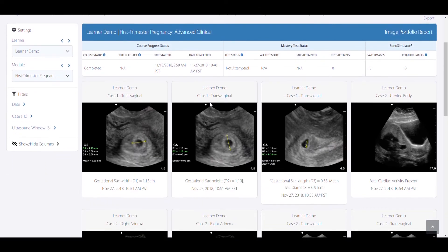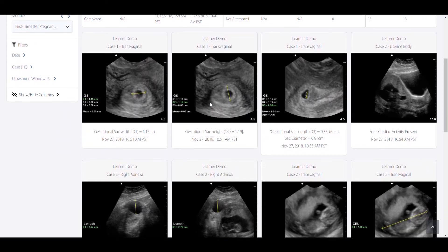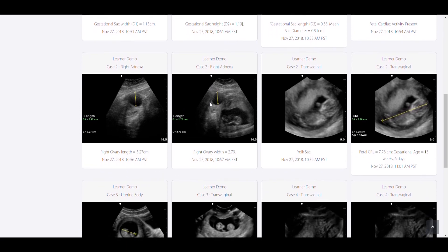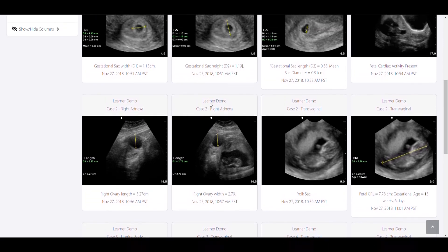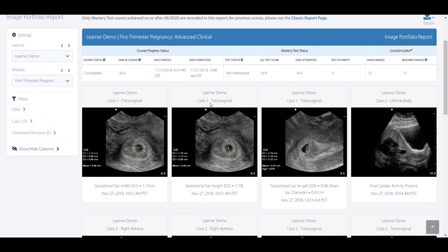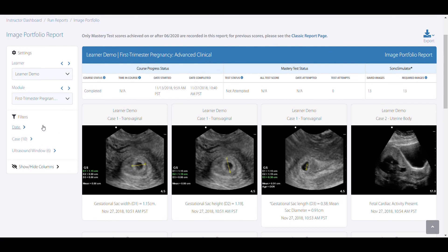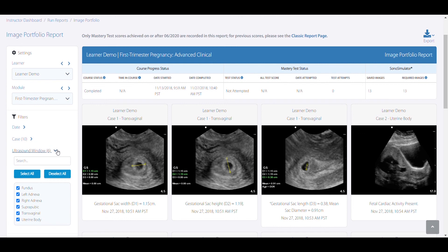Lastly, the Image Portfolio report allows you to see an entire learner's image library from a specific module. Filter by date, case, and ultrasound window to only see images of interest.